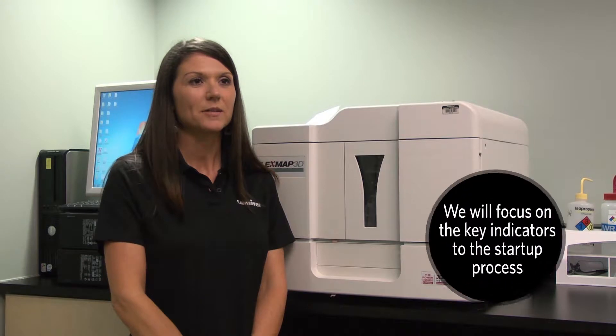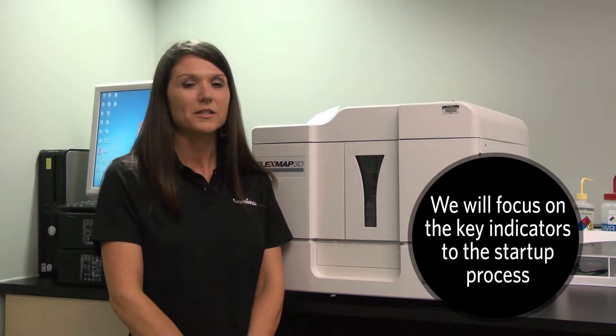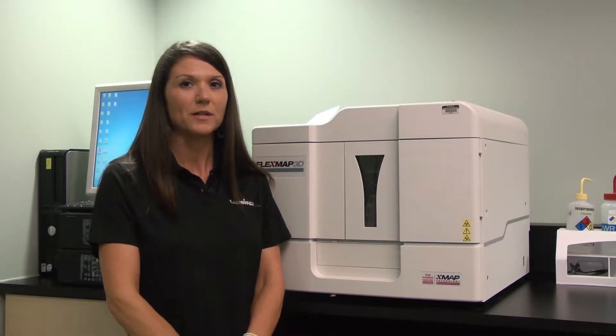Hi, my name is Chrissy Norton. I'm a technical application specialist here at Luminex Corporation. And today I'm going to show you a quick tip video on the startup indicators for the FlexMap 3D instrument.